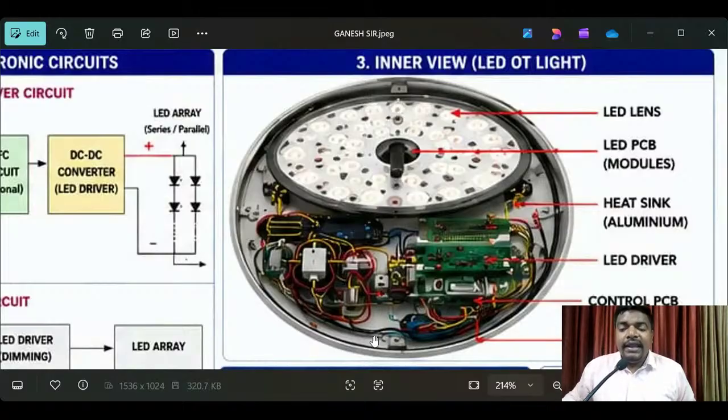See here, the wiring, why? Because it connects and communicates with every component. You see all these electrical and electronic components available inside the dome. So that many functions go to a single output, which is proper, shadowless illumination, and it is the focusing the doctor uses. I hope you got it very clear right now.